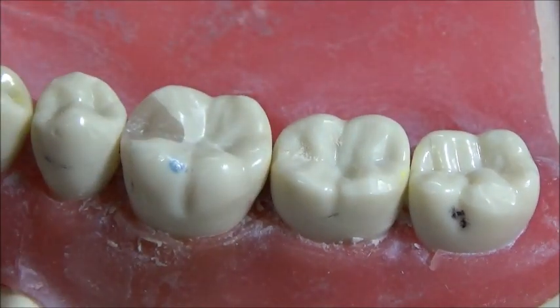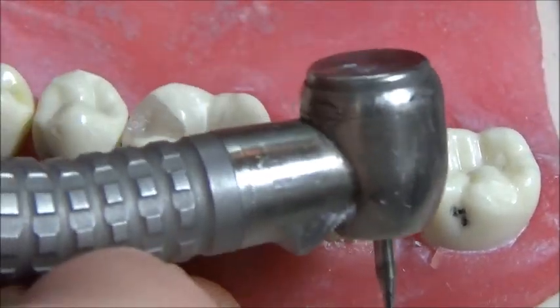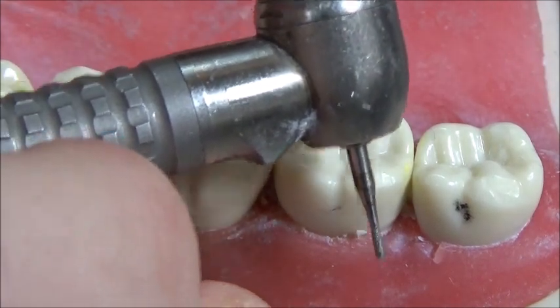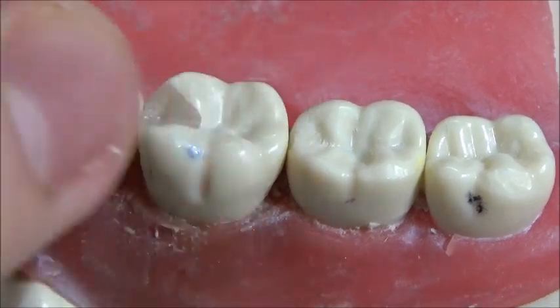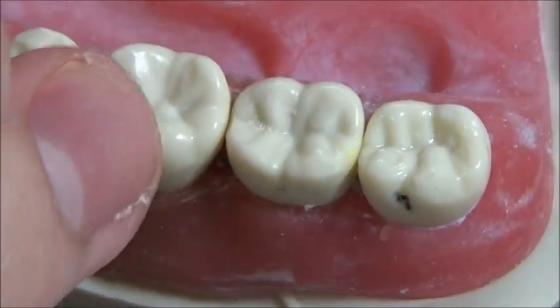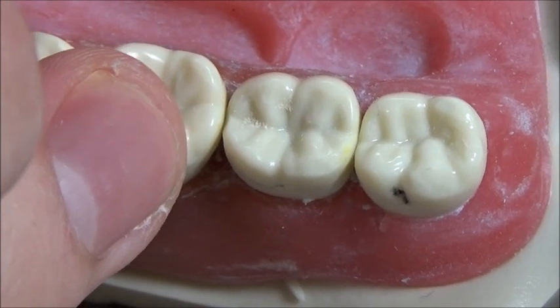Hello, and this is a demonstration of a class 1 filling. This is an air turbine handpiece. You also have electric, and my preferred setting for electric is to use 100,000 RPM with the 1 to 5 ratio setting.